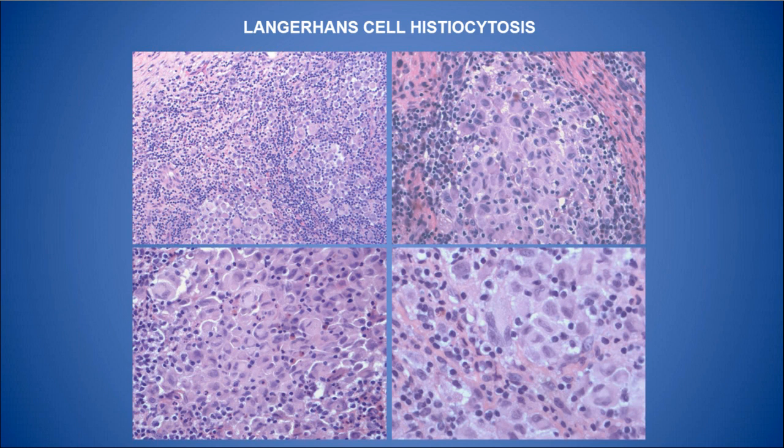Eosinophilic granuloma has an accumulation of histiocytes that form ill-defined granulomatous conglomerates surrounded by lymphocytes, plasma cells, and eosinophils, as we can see here. Those histiocytes have an ample amount of amphophilic to pale basophilic cytoplasm, and the nuclei are variable. Sometimes they may appear multinucleated, but most of the time the single nucleus has longitudinal grooves or folds that impart that sort of coffee bean appearance.